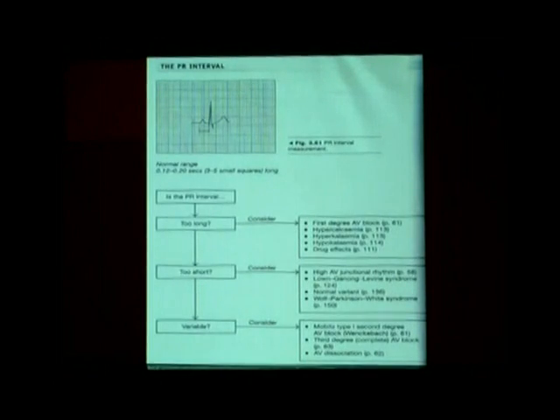Then we look at the PR interval. What does the PR interval represent? Now you have become a little more informed about ECG. You should not call it AV nodal delay. You must say AV conduction. It's not only the delay. Most of the PR interval is contributed by the AV nodal delay, but it is not purely AV nodal delay.